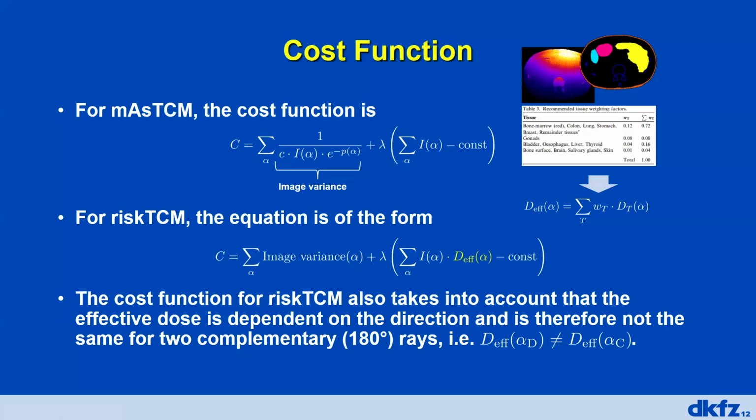Okay. So what the scanner would do would be to reduce the mAs, the number of photons impinging on the patient, but we also have the kV as another setting. So that would be the second question. How far are we from modulating the kilovoltage as well?